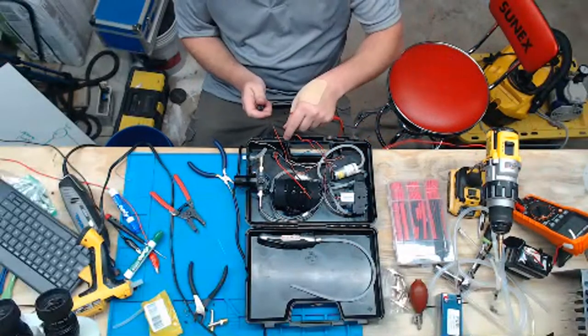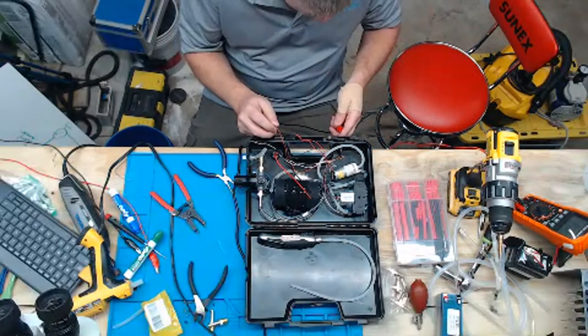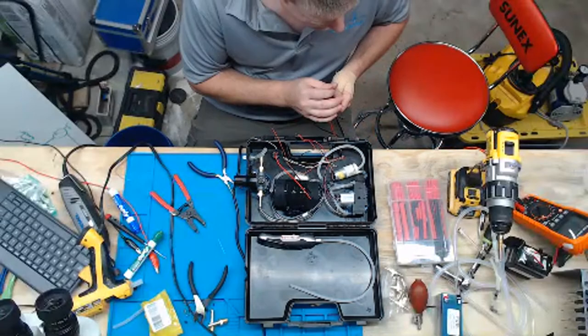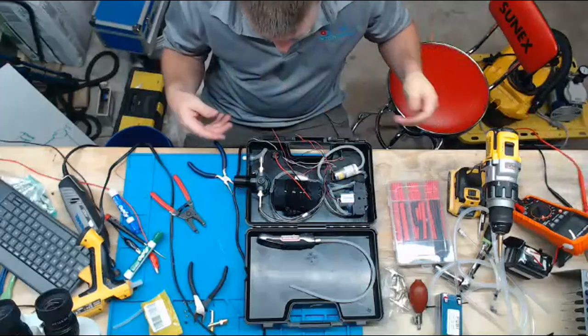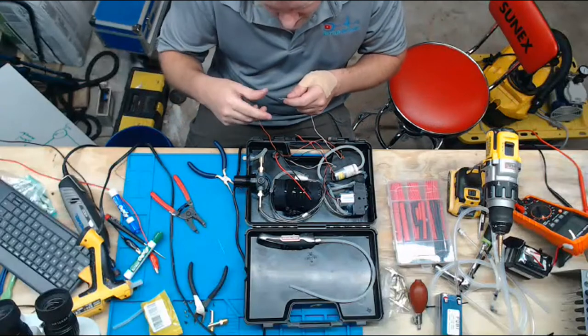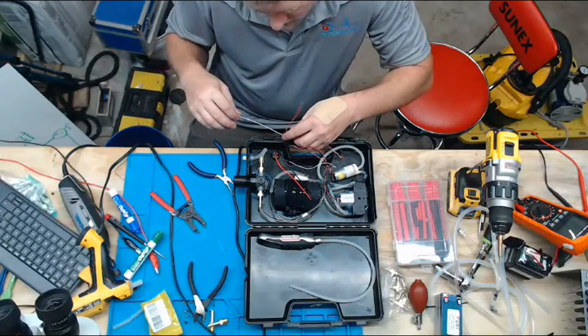And I would like to guess, but I hate undoing my work. So I'm just going to take a continuity measurement. Okay, so red goes to the outside. You wouldn't normally think that. You'd think that red goes to the inside, which is normally your positive pole. So, okay, it's white.